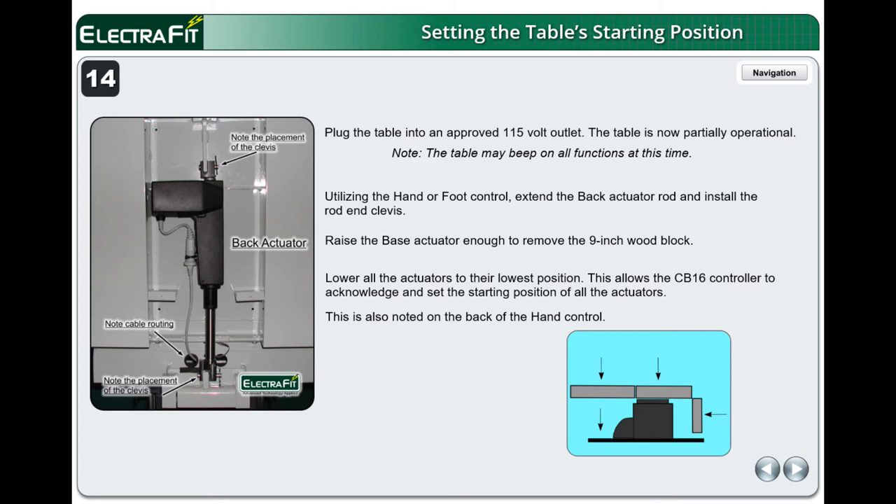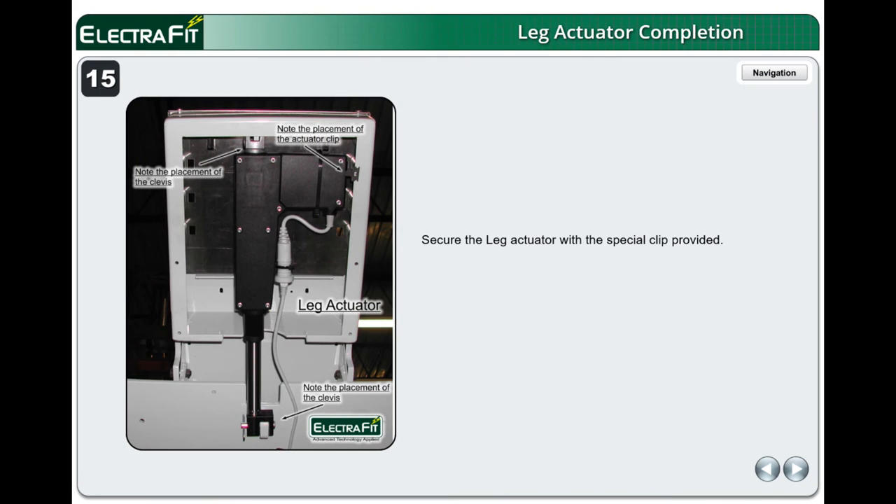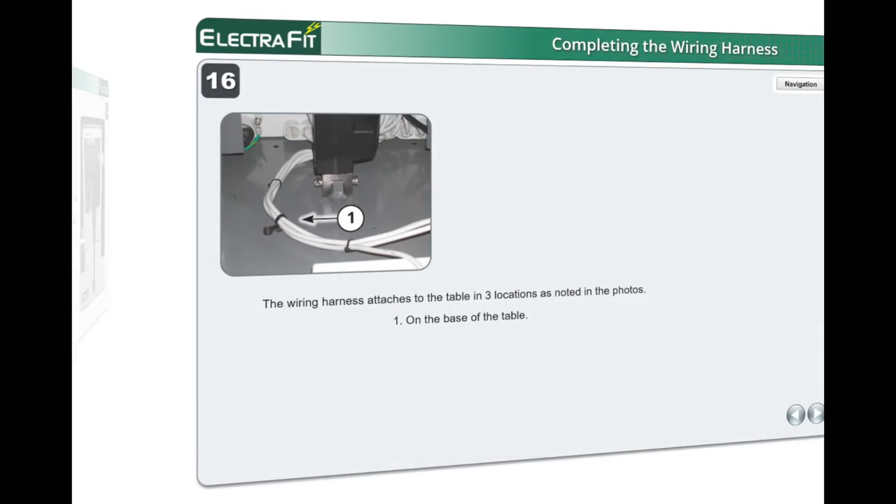Lowering all actuators to their lowest position allows the CB-16 controller to acknowledge and set the starting position of all the actuators. This is also noted on the back of the hand control. Secure the leg actuator with the special clip provided and tighten the set screws.